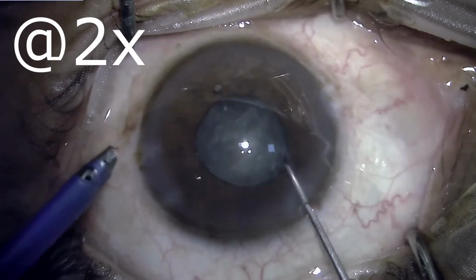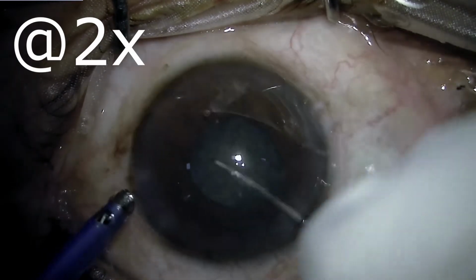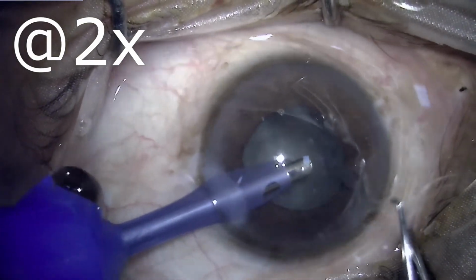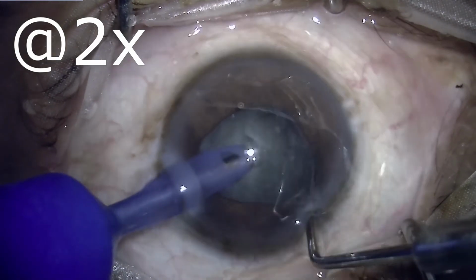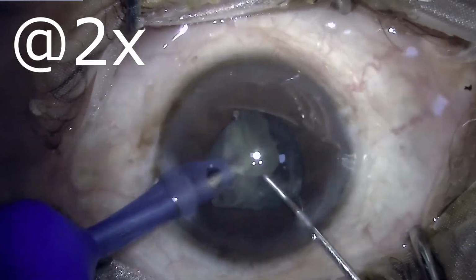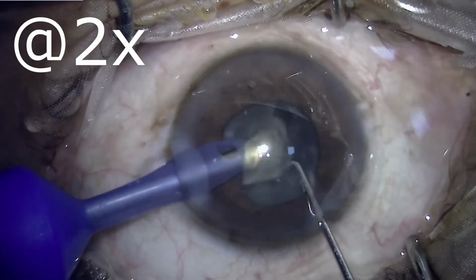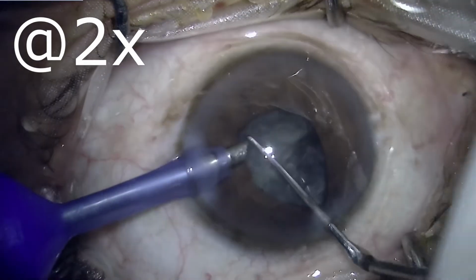Proceeding with the phaco-emulsification with more determination, and rotation of the nucleus has been done so as to aid in proper positioning of the nucleus chunks. This portion of the video is being run at twice the speed. Although the iris flutter and prolapse of the iris, or rather the flowing of the iris towards the corneal incisions, may be a traumatic experience for the iris itself, but at times it aids in the dilatation because the portion of the iris tissue which goes towards the wound causes little dilation of the pupil in that particular segment.